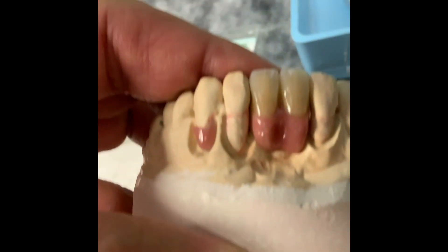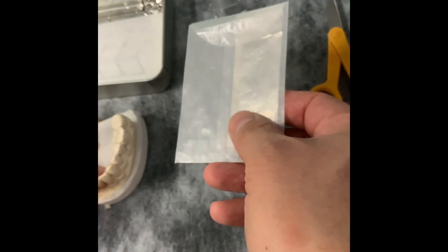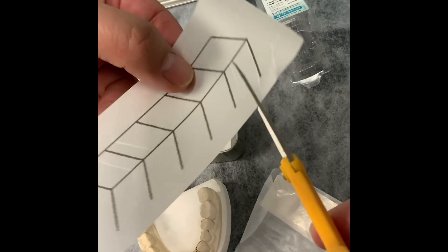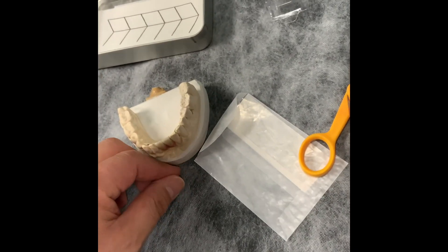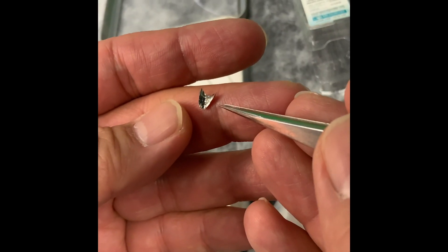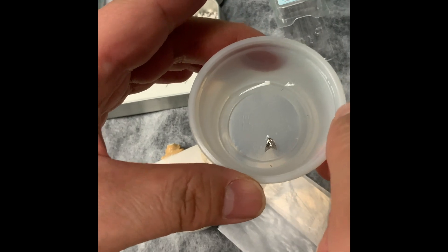People are asking me what kind of stick to use — here's the stick, you can call the company. I did not get any commission. Here is our Algin Corporations platinum foil. First we take out the sides and cut it exactly to what we need. Then we have the foil, and after that we use a tweezer to take it out. Peel off from inside, and you'll see the pure porcelain. I always put water first — then you can take it out easily. Put it in for a couple of hours and that'll be great.